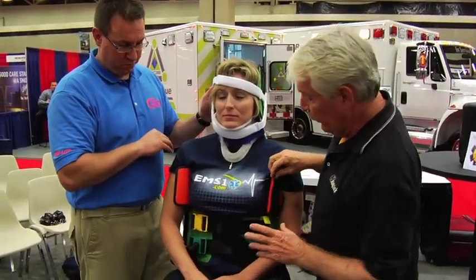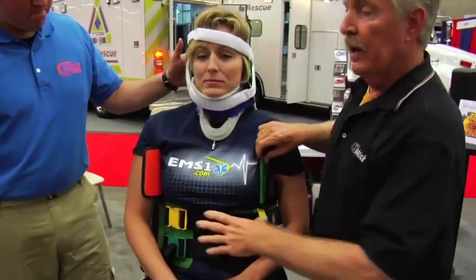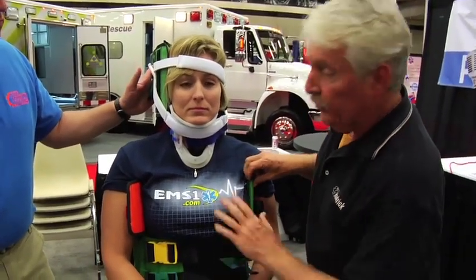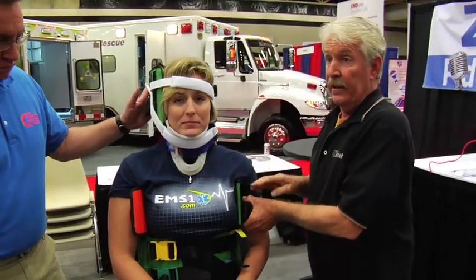One change on this Code 2 that's a little bit different is that we have these top flaps. You can turn them back independently for women that are a little more large up top, or you can leave them out. You can turn the bottom ones back if the patient is pregnant. There are so many different ways that you can strap, and this gives you some of the versatility.